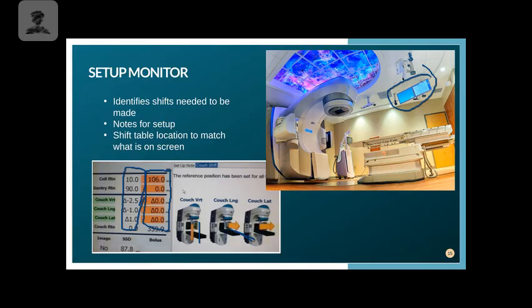which doesn't seem like it should be a challenging thing. But when you're trying to do the mental math of, oh, I am at 1.25 on the right side, I'm positive, but I actually need to shift 3 centimeters to the left, you're doing mental math and having to subtract it and figure out where you are. So that definitely took a little bit more for me because I'm not the best at mental math. If you ask me to write out a hard equation, I can solve it very easily. But trying to think about it in my brain and do the numbers right there was more challenging for me. But it's something that you definitely learn when you're in the clinical setting and as you are a therapist.